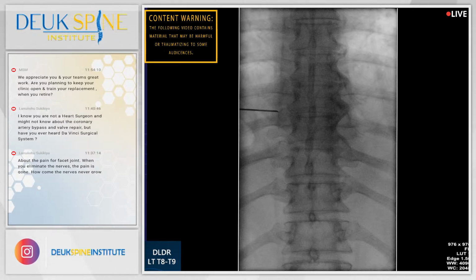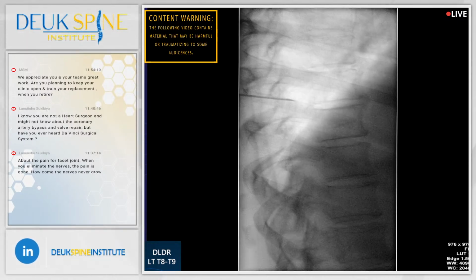It's the same situation. There's something there blocking us. Bony. That's it right there?